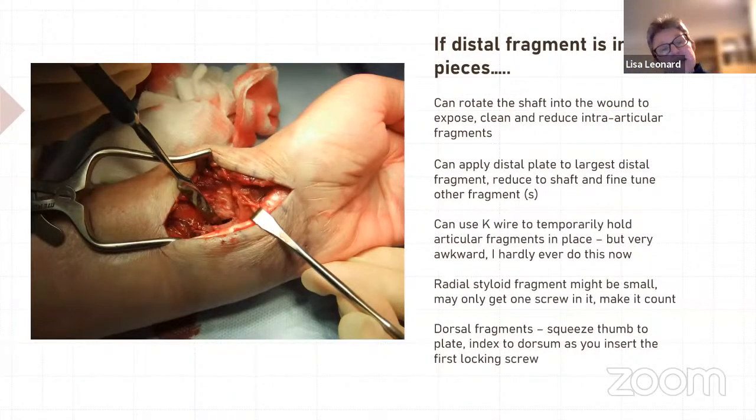You can get the plate onto the largest fragment and then tweak and adjust the smaller fragments once you've reduced that onto the shaft. You can use K-wires to temporarily hold fragments. I don't find that terribly helpful these days. I rarely do that now because they usually get in the way. And then if you've got some dorsal comminution, as Lindsay said, you don't need to fix absolutely every bit of that, but if you can compress down a significant articular fragment while you're inserting the plate, in between the fingers and the thumb, that's a good trick there as well.